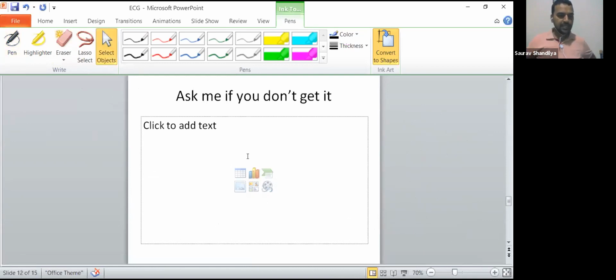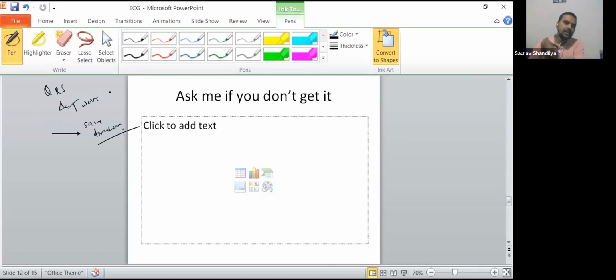So this is cool. Now here, see a new picture. After the T wave, I think you should not remember anything. The important point you have to remember is that the QRS complex and T wave should always follow the same direction. Same direction, QRS and T wave. Okay. Why? It's very simple. After depolarization, you should have repolarization. That's it, nothing else.